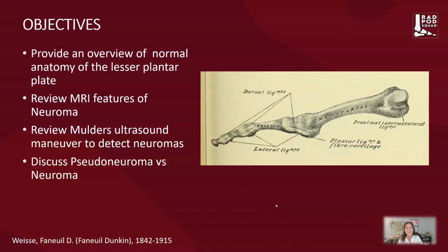Our objectives will be to provide an overview of normal anatomy of the lesser plantar plate. Again, I'll review MR features of neuroma. We'll review Mulder's ultrasound maneuver to detect neuromas, and I'll discuss pseudoneuromas versus neuromas.